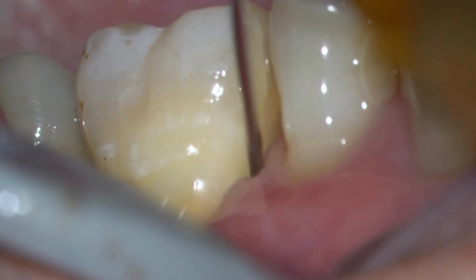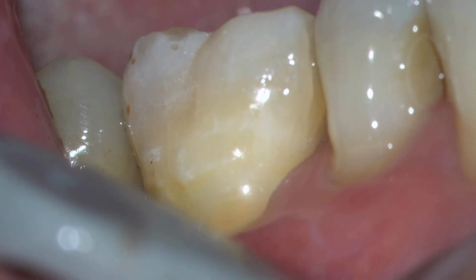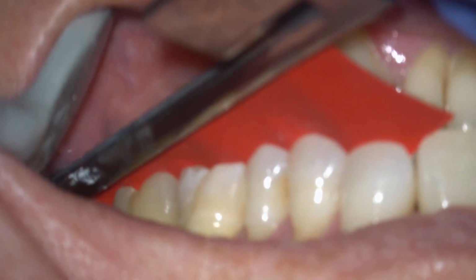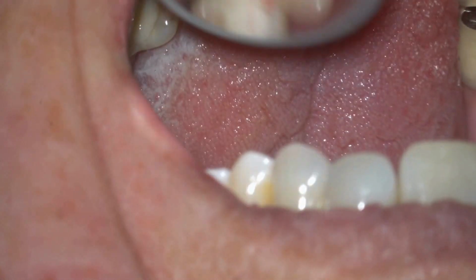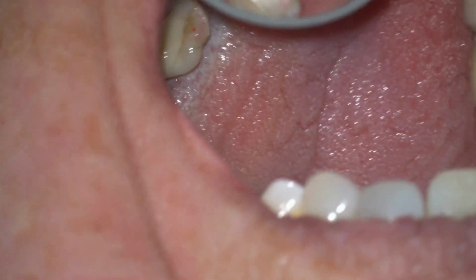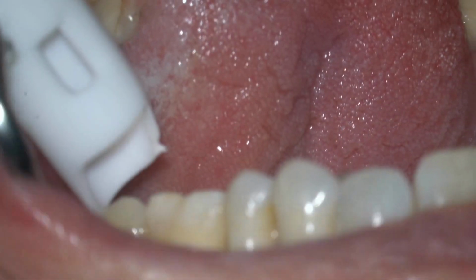Now I'm looking at the side where that Cavit was sealing the external communication, and interestingly, over a month the gum tissue had grown back over that external opening. Go ahead and check the occlusion. Occlusion is fine, and we're ready to go ahead and take our final radiographs.